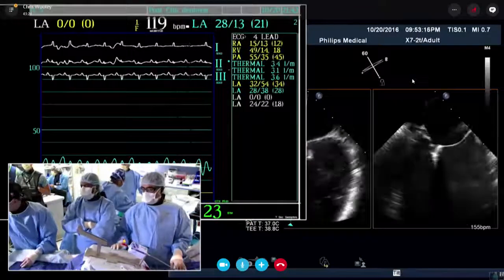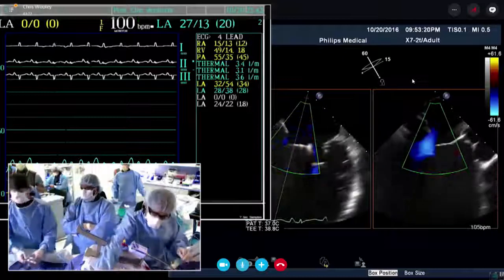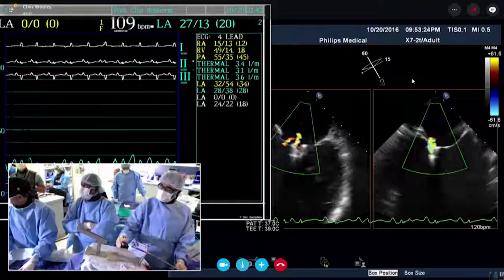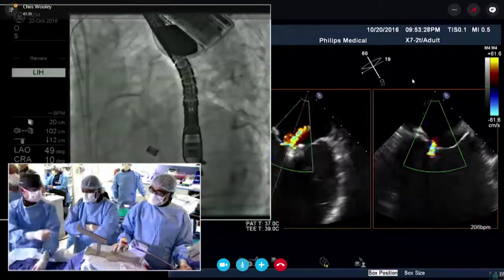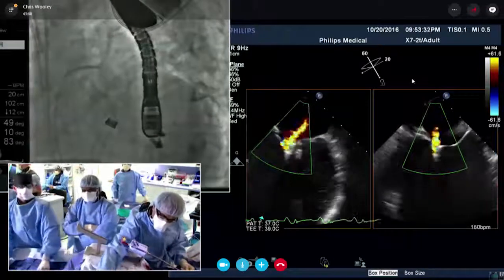What do the members of the panel think? We have some very famous echocardiographers over there. What do you all think? I think, Saibal, this is a terrific result. I would not do anything about that medial jet. Given the patient was so sick, this is going to do a world of good for this patient. I would not do more.